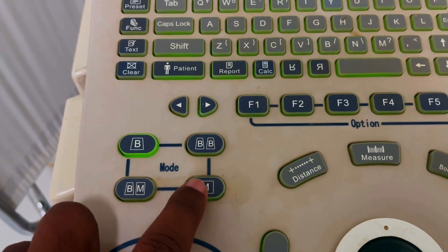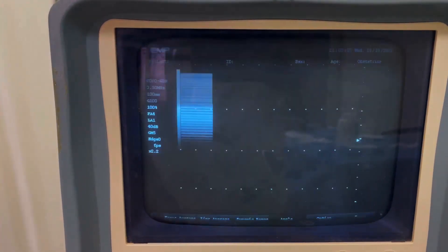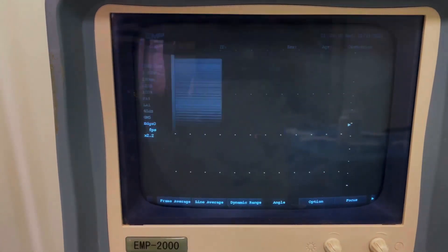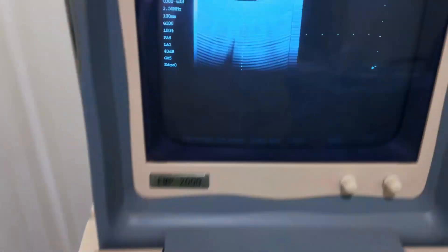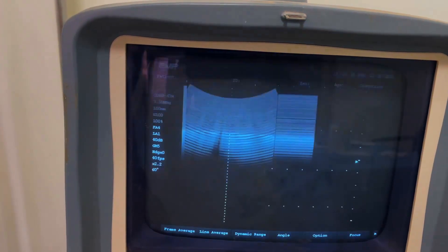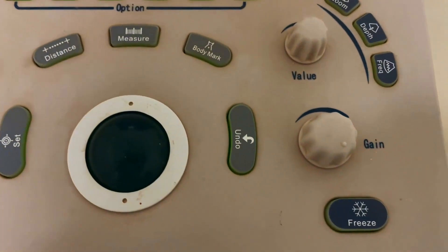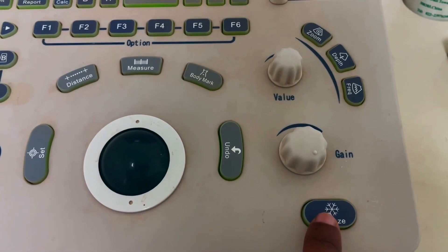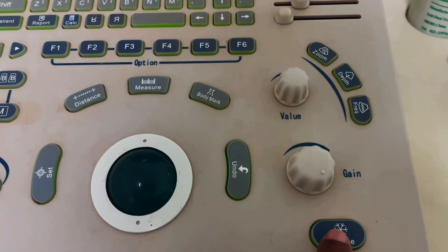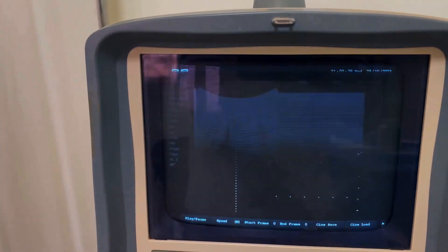If you press M, it will show you cardiac mode, which helps to measure heart rate. If you press the BM button, it will show one single view and a cardiac view mode. Just press the freeze button to freeze and measure your heart rate as you like.